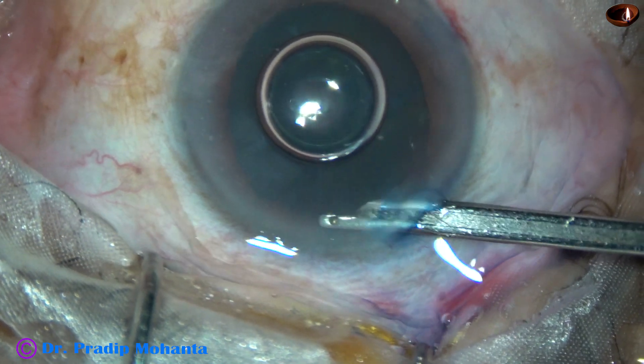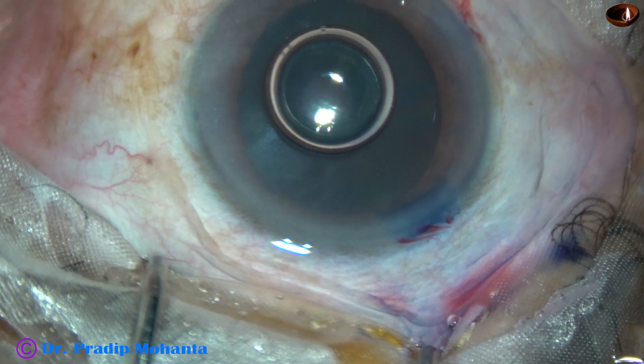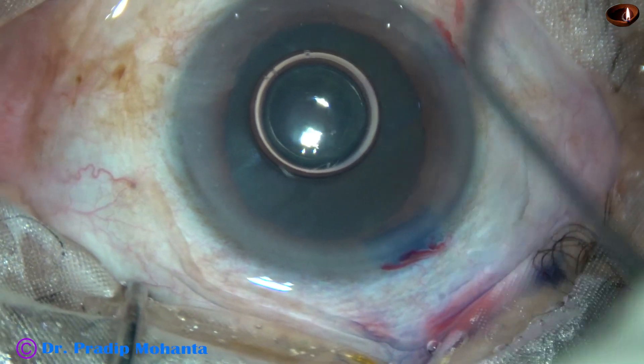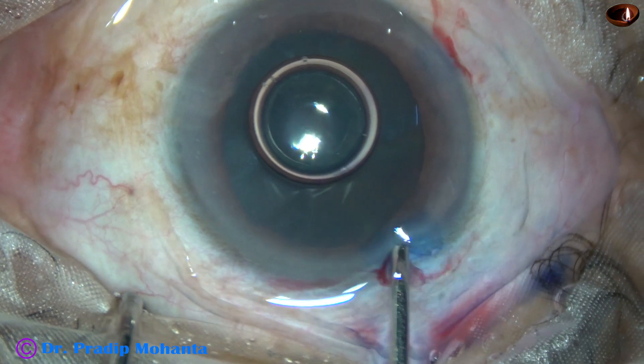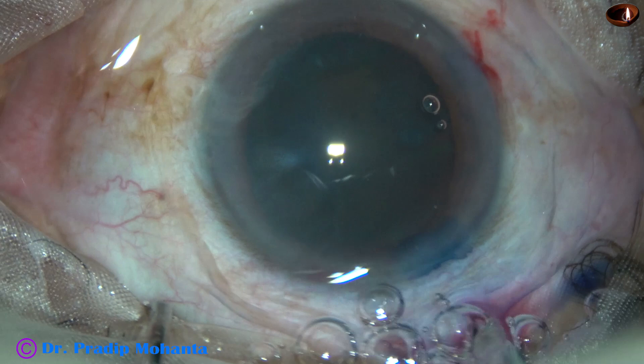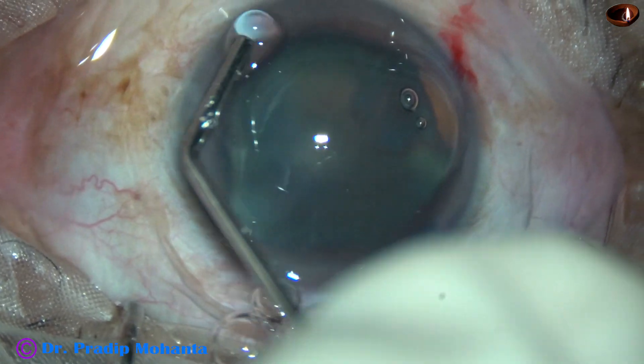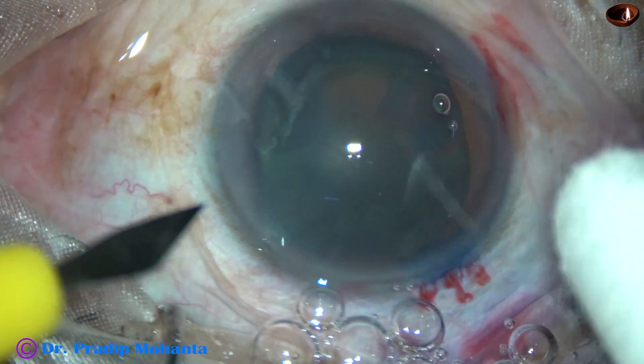Now 2% hydroxypropyl methylcellulose is injected to fill the anterior chamber. It is applied over the corneal epithelium for better visibility.